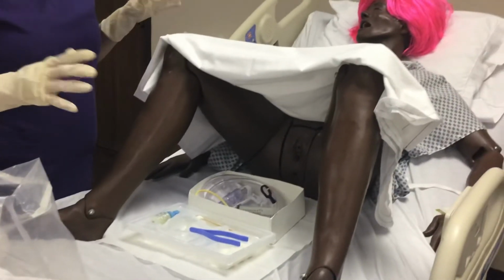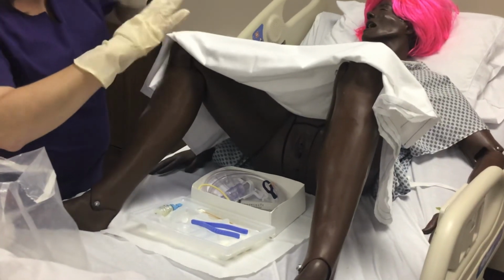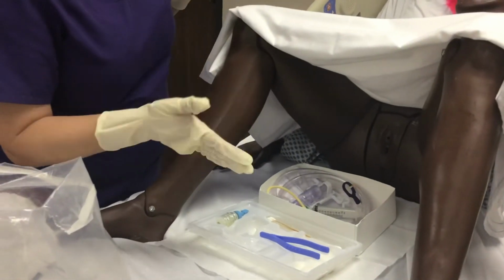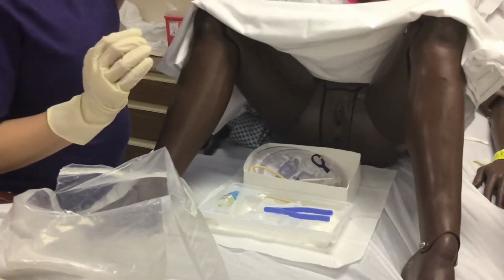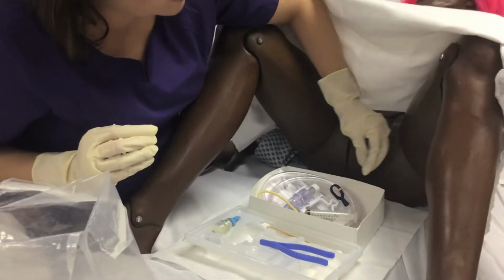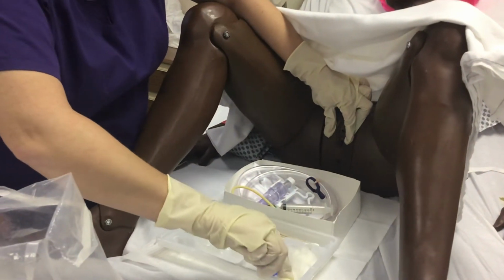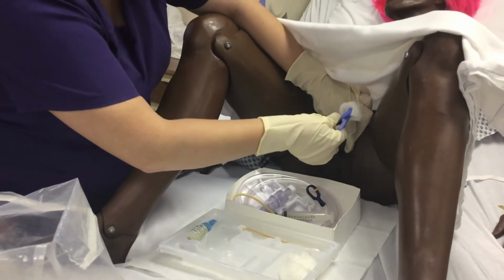All right, now, Mrs. Shelton, the first thing I'm going to do is clean so that we don't have to worry about running the risk of infection or anything for not cleaning you properly before we inserted your catheter. I've soaked the cotton balls in betadine solution, so it's going to feel a little cold. So please excuse me. I take my non-dominant hand, avoiding the sheet, pushing it back with my elbow. I'm going to spread out the labia. Now I'm going to take the cotton ball, trying to avoid dripping anything on the catheter.